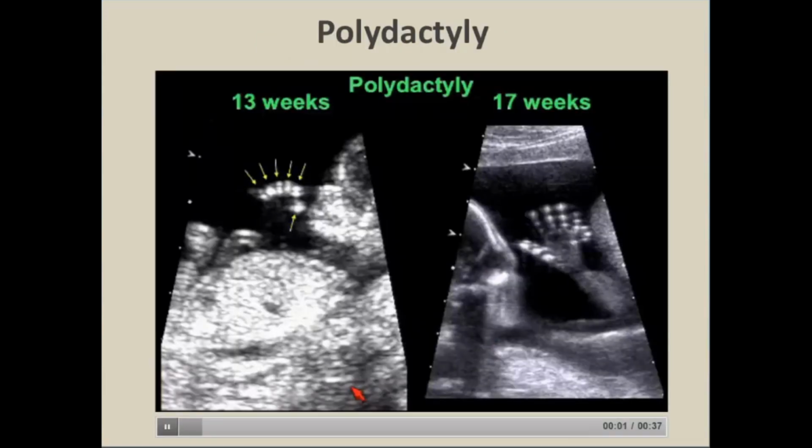Occasionally, you'll pick up some abnormalities. This fetus has polydactyly. I was scanning this fetus, and I thought there was one too many, and I was a little bit concerned, but at this age, I'm not sure I would call it. But the astute father sitting in the chair watching the screen said, "Oh, does that fetus have an extra finger?" Well, what am I supposed to say? So I said, "Well, I think maybe it might." And he said, "Oh, I was born with extra digits."